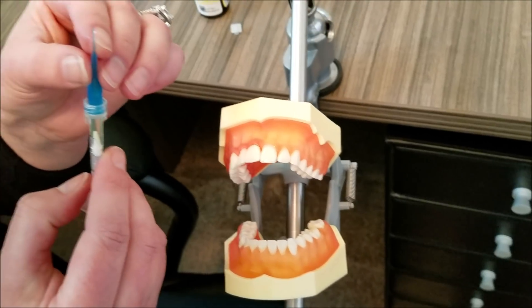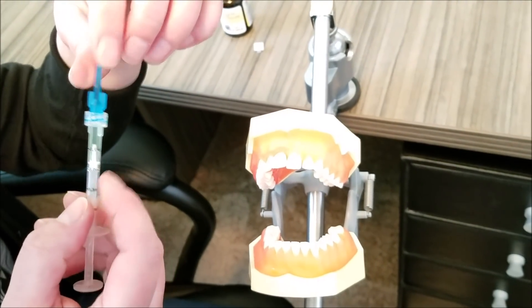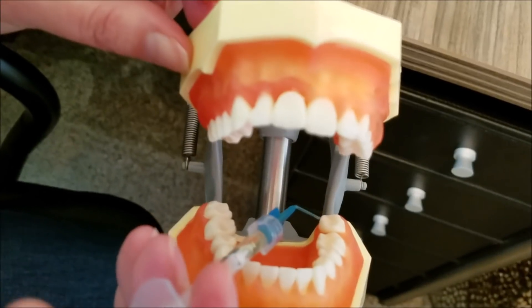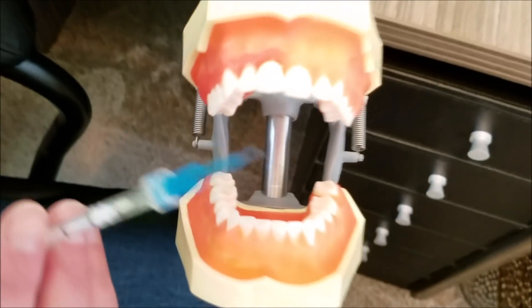Notice the pliability of the tip, which makes it easy to reach — let's say the distal here of tooth 18. It really is easy and comfortable to apply. In fact, a tiny drop into the periodontal pocket takes barely touching the plunger of the syringe at all. It's a viscous liquid that is so easy to control.